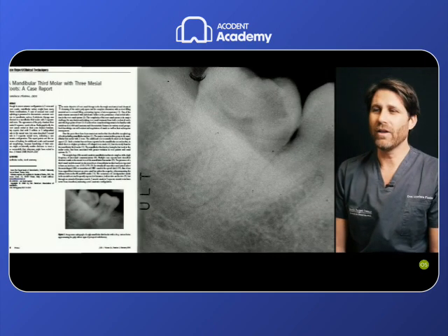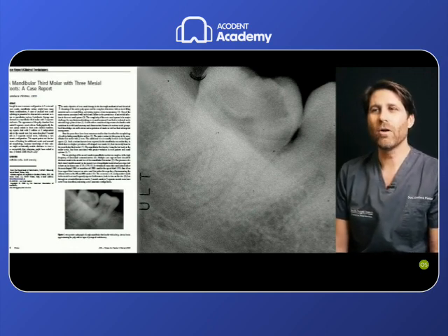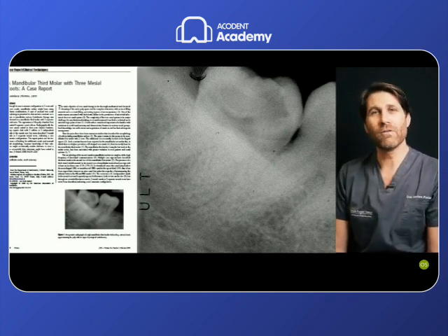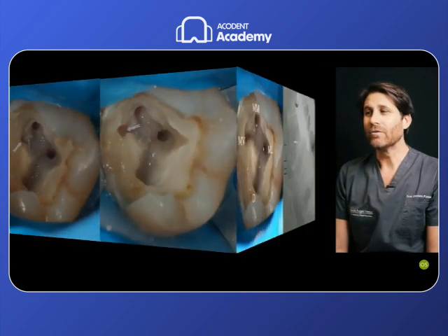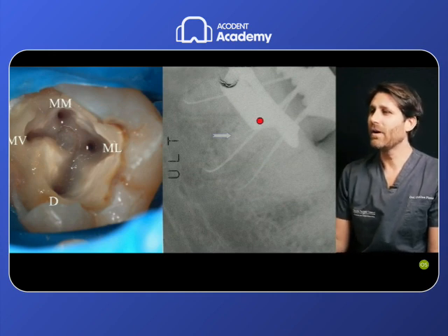This is a case that I published in 2008 of a mandibular third molar with 3 mesial root canals, a case report published in the Journal of Endodontics. And in this case, at that time, using rotary files, I found 3 separate roots in the mesial portion of the tooth, and 3 separate root canals, and I established the glide path with manual stainless steel files up to the terminus.